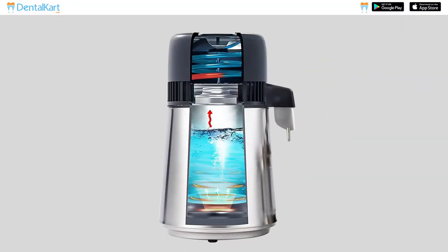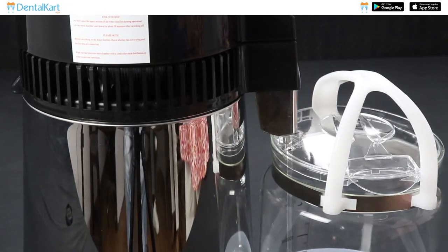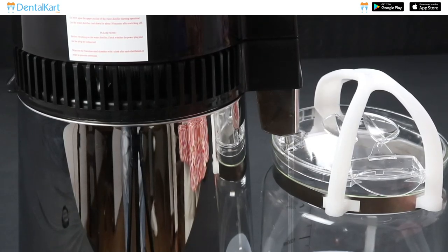Turn on the distiller to initiate the distillation process. The water in the chamber will heat up and turn into steam. The steam will cool down and turn back into liquid form. The condensed, purified water will drip down into the collection container, separating it from the impurities left behind.